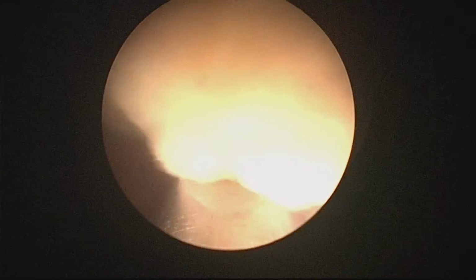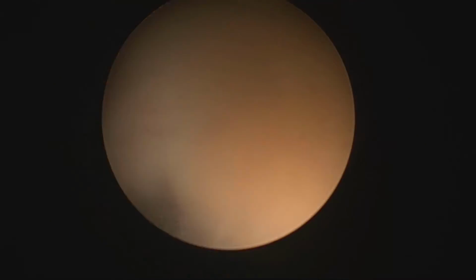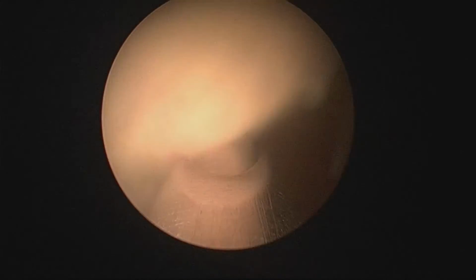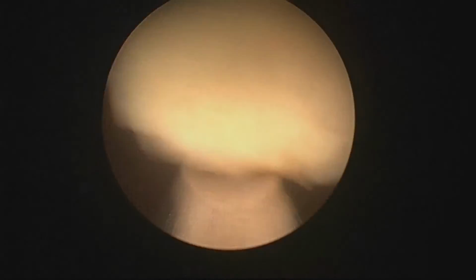But this is the Piranha morcellator. I love it. I think it's excellent, really fast, and it really, really helps to have a good morcellator because it shortens the operation time significantly. Here you can see that we did the stone in the diverticulum and the enucleation. It's been now 24 minutes.